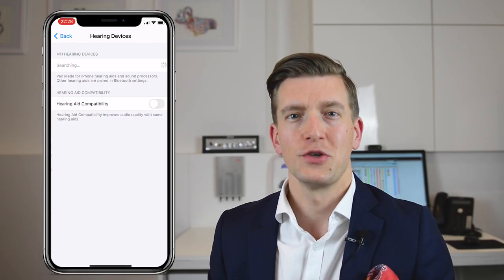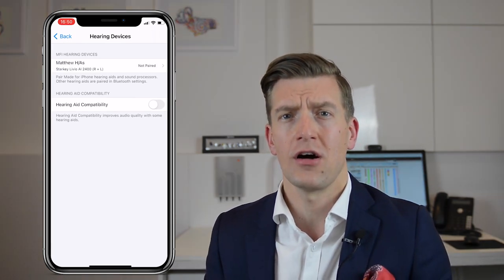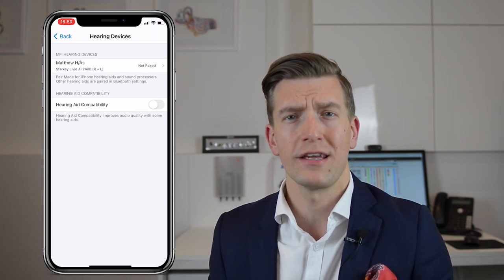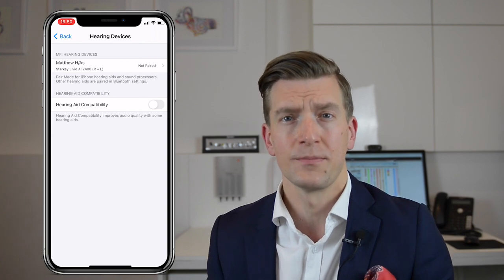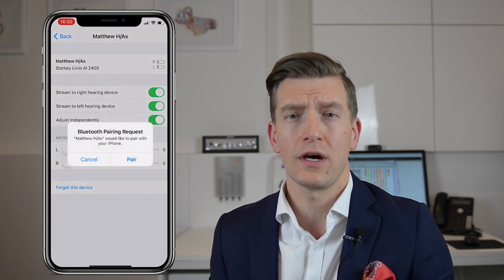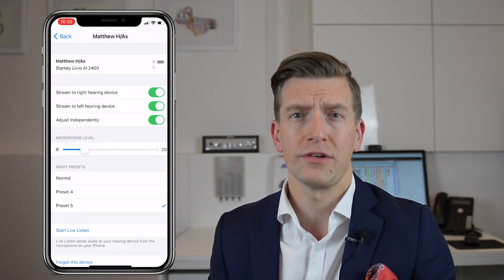Step three. Your name should now appear on screen. If you're wearing two hearing aids, you should see R plus L, standing for right plus left. If you're wearing just a right hearing aid, you'll see an R, or if it's just a left hearing aid, you'll see an L. Click on your name and it will prompt you to pair with those hearing aids. It will prompt you twice if you're wearing two hearing aids, and once if you're wearing one hearing aid.